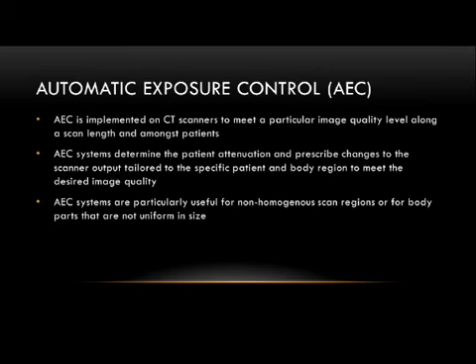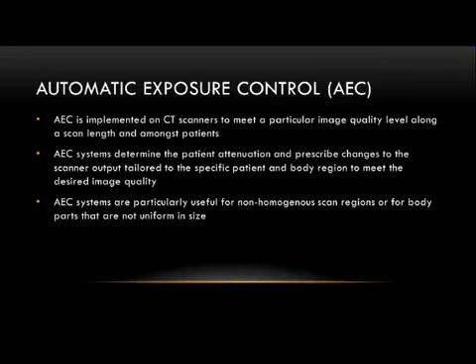I again was remiss in this talk in not having screenshots of how to get to that very, very, very important AAPM page for the CT working group on standardization of nomenclature and protocol. Because not only do you have the lexicon there and slides about suggested protocols for the different vendors, but also the CT dose education slides live there. And this will actually be the only interactive portion of this talk.